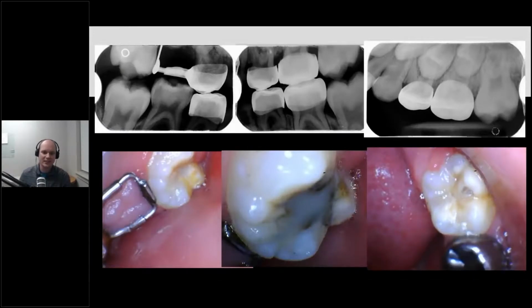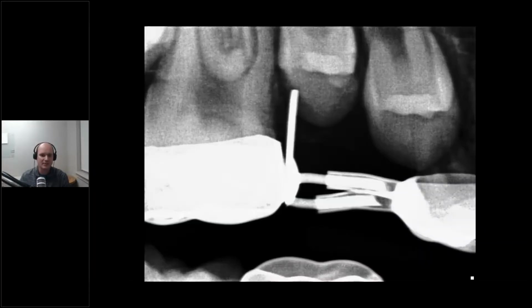This is a young individual that came in with a hypoplastic molar, tooth's just erupting, already has a cavity. She was not cooperative. She would not really sit in the chair or open. We were lucky to get this done. We applied silver diamine fluoride twice and then a glass ionomer over that. And that bought us some time. And we also did that for her lower molar, and now she's got a nice result. We were able to restore that with the stainless steel crown at a later visit, and she's going to have a long life with that tooth.